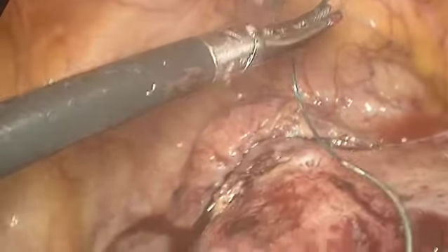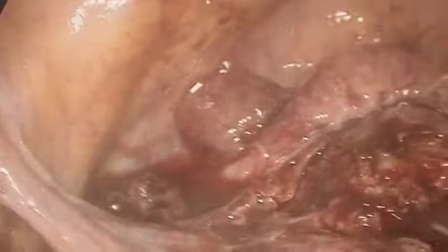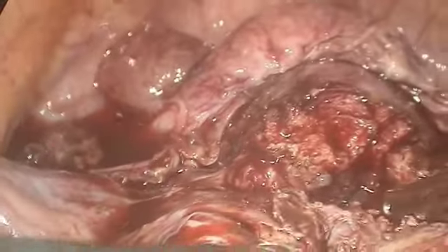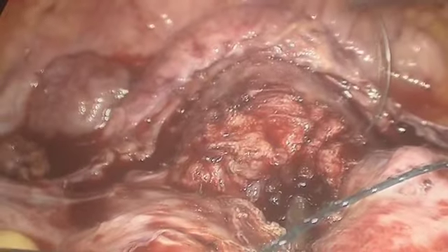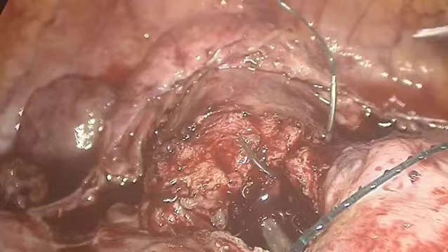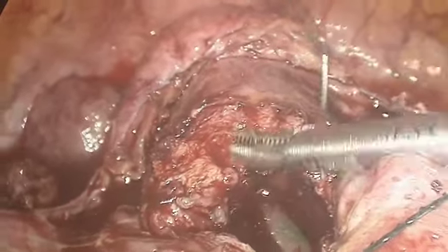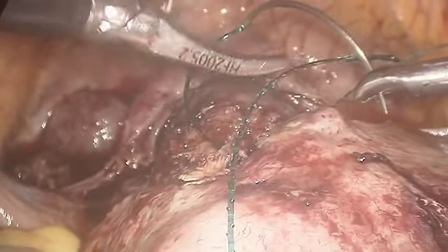Step 7. Closure is now performed with a barbed PDS V-Loc suture. Notice the technique. Suturing starts at the right corner and proceeds across without tightening after each bite. This way, visibility of tissue edges is maintained.